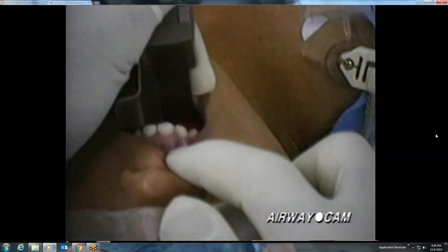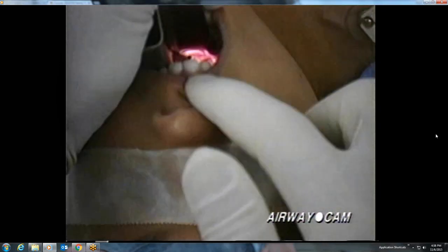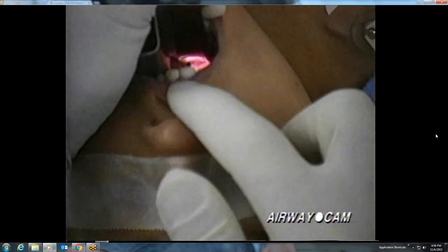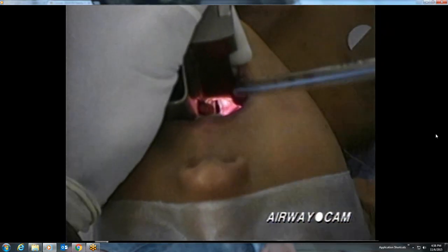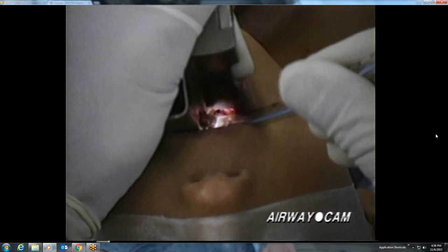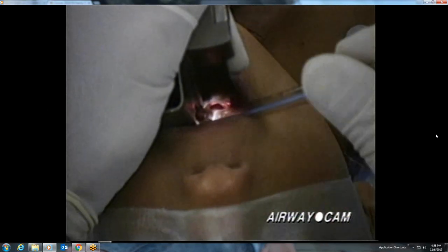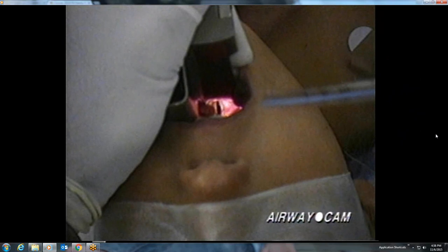This next case involves laryngoscopy on a 5-year-old child with a Macintosh No. 2 blade. A very sharp view of the vocal cords is achieved and a cuffless endotracheal tube is inserted down the right side and into the larynx. Note the large vestibular fold adjacent to the vocal cord on the right, and that the anterior commissure of the vocal cords is well seen in this patient.